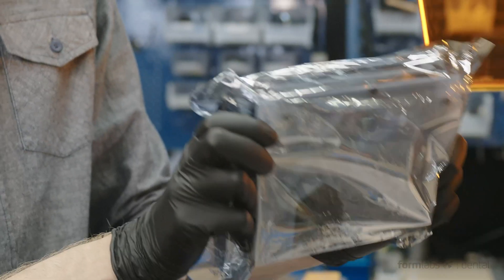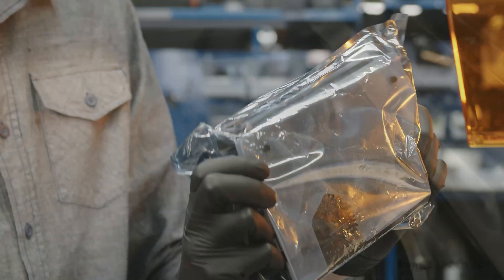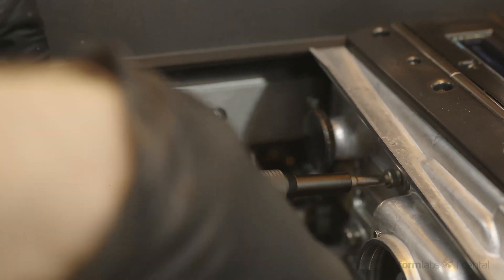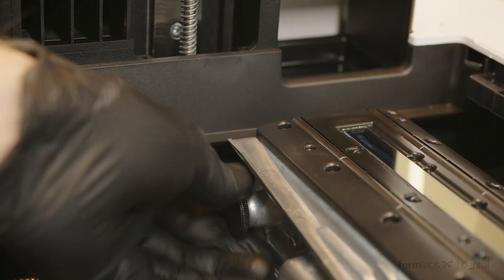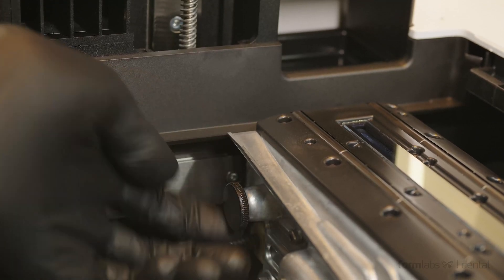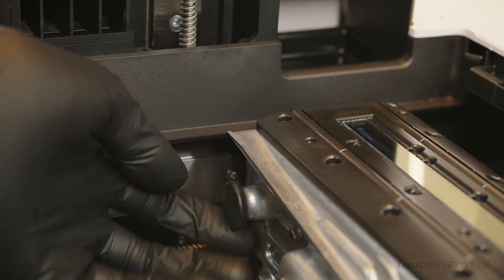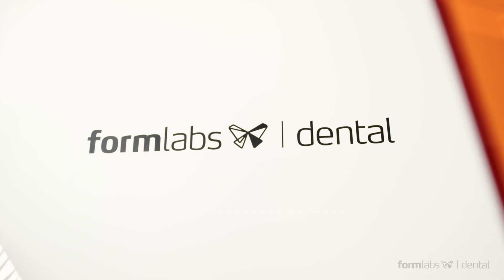We also made it easier to replace many of the Form 3B's major components yourself, minimizing the need to send a printer in for repairs and increasing uptime.